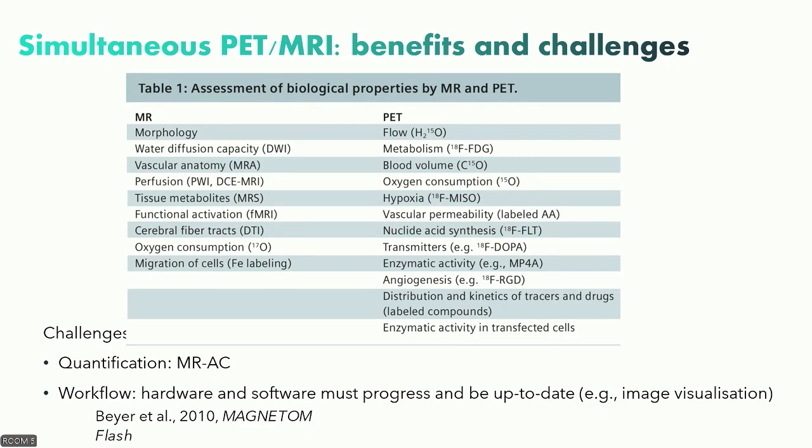It just estimates the glucose consumption at the level of the cortex and of the subcortical structures. If I acquire an optimized functional MRI that also allows me to estimate a PCASL and measures of cerebrovascular reactivity or mitochondrial function, I could extract a lot of information and correlate the metabolism measured by FDG and the cerebrovascular activity measured by optimized, calibrated fMRI methods.